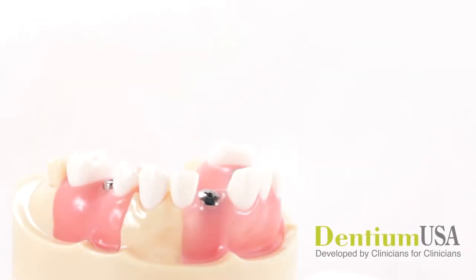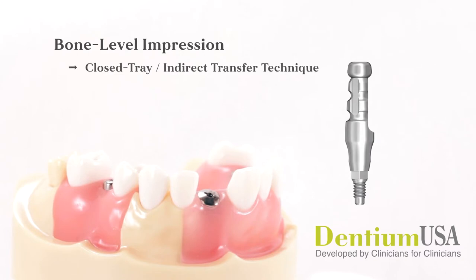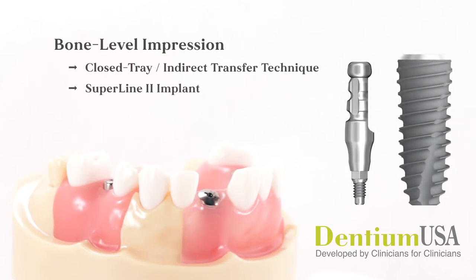This video demonstration will review the steps necessary for making a bone level implant impression using the closed tray or indirect transfer technique. A Dentium SuperLine2 implant will be used for this example. Please note that the open tray or direct pickup impression technique is covered in a separate video.